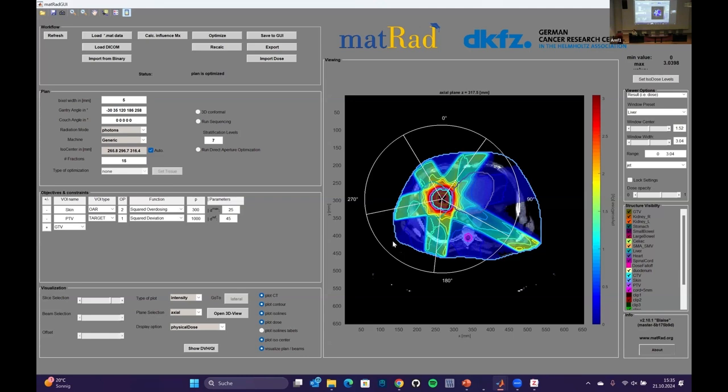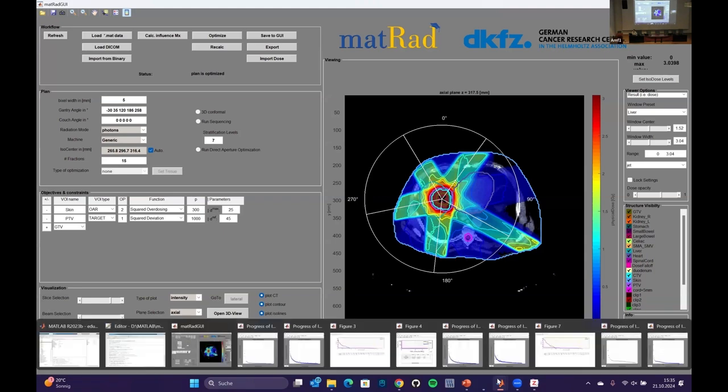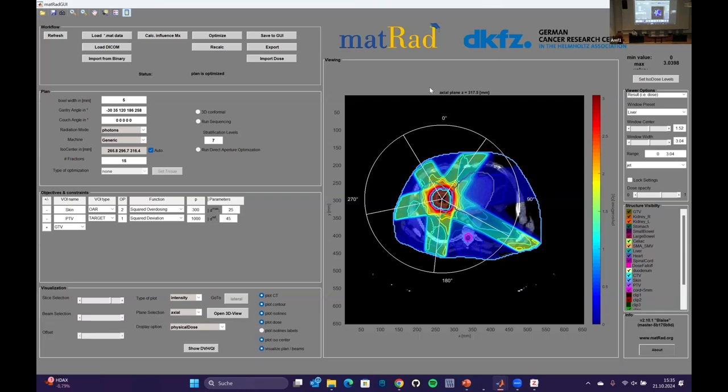Yeah. There was a question here. Yes, there is one more question. I don't think that you answered it, but there is a question about again optimization of the dose in a target for transmission of proton beams. So do we have this possibility? I will try to read it once more myself. Optimize the dose for transmission proton beams.